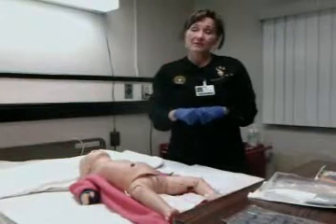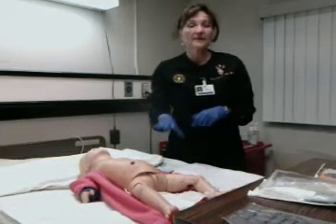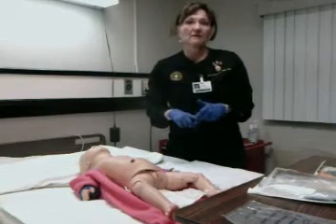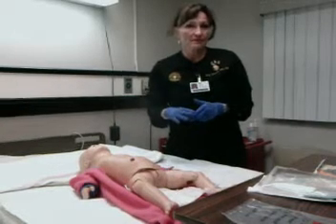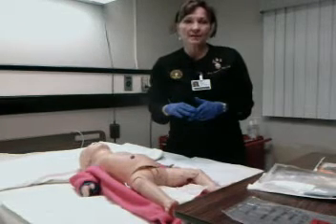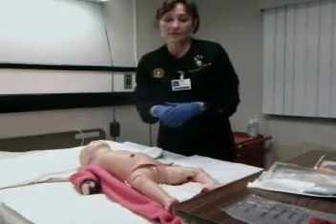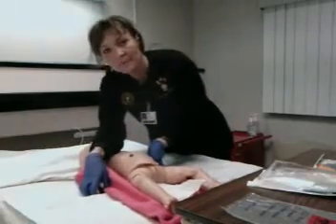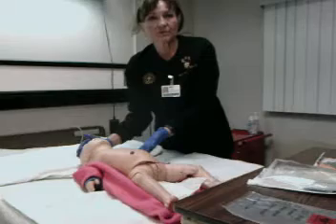Welcome back for stage two. The next section you will see us filming is pretty much just myself and the baby. Number one, your red flag should go off because I would never do a straight cath by myself. We would also probably not have the parent help with this procedure. Remember, there are going to be three or four of you doing the simulation, so make sure you use all the bodies available. All of you have been in clinical and most of you have seen how wiggly these little babies are during nasal suctioning.